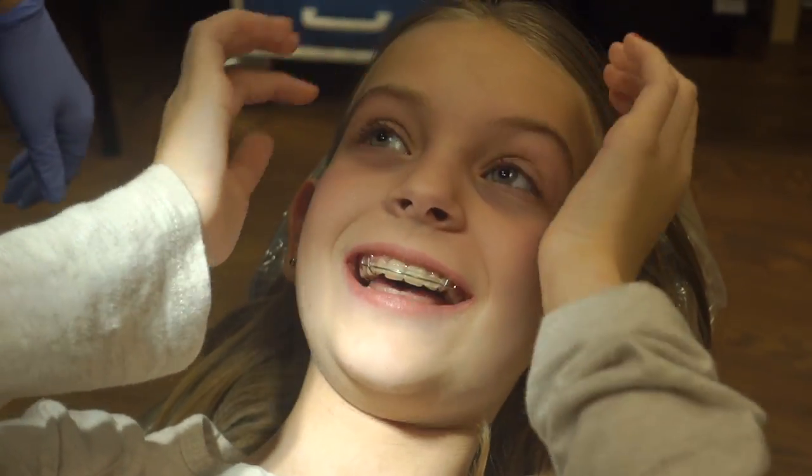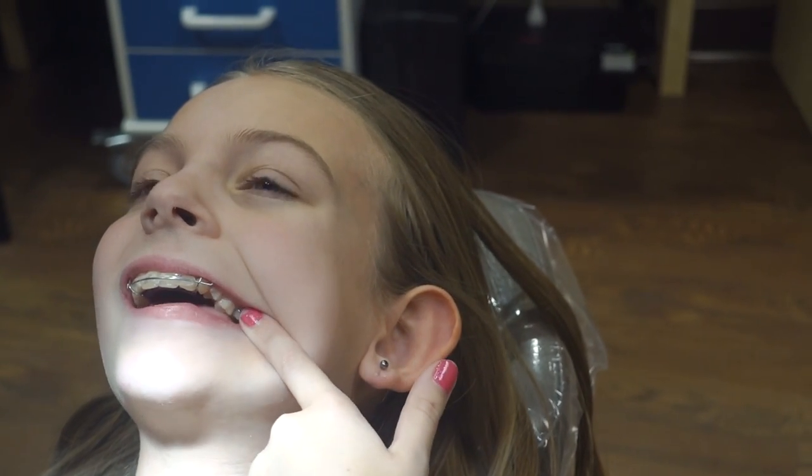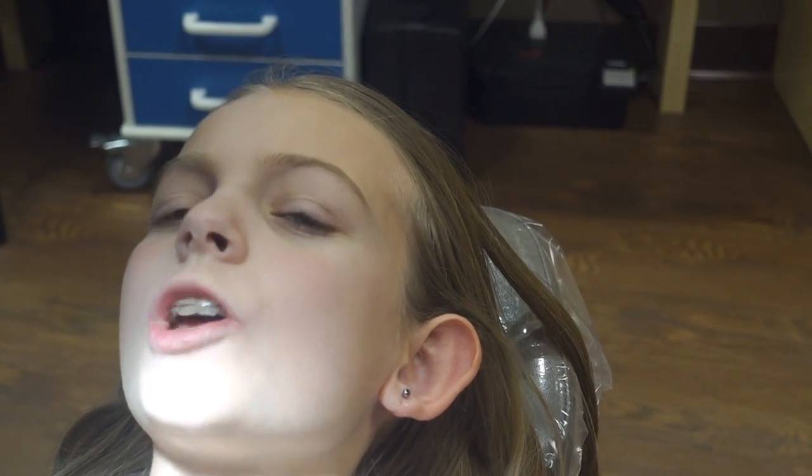How's it feel? Does it feel better than it did when you got here? Let's see if I can see it. I might have got it. It feels better? How's the mouth? It might be a hair. You can wear it like that? It feels comfortable. It's probably because you haven't been wearing it — it's going to feel tight and make your teeth feel a little sore.